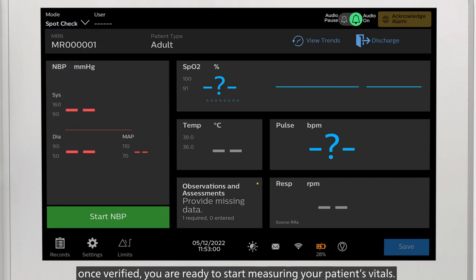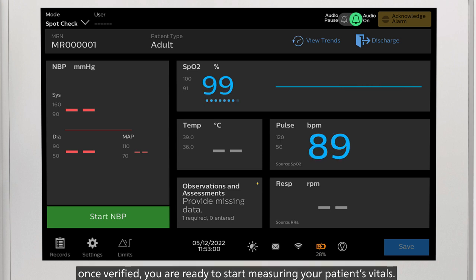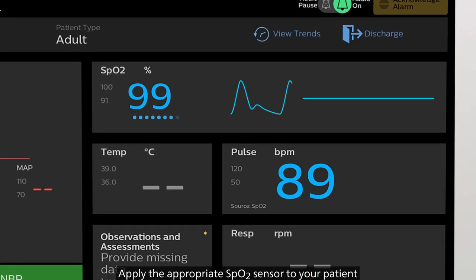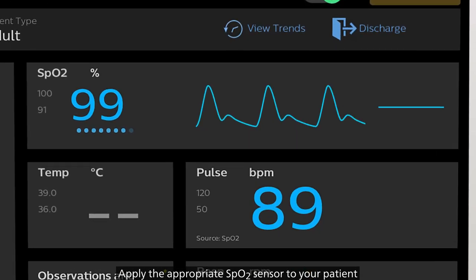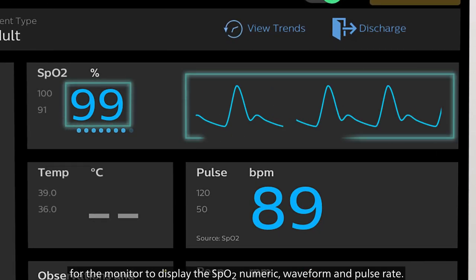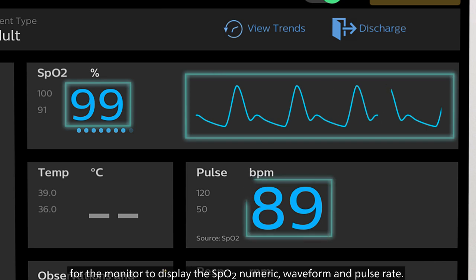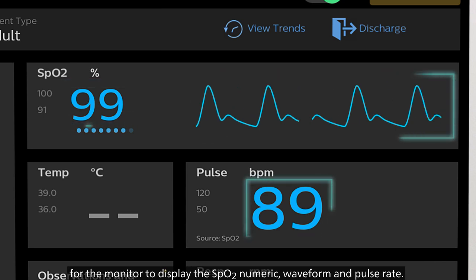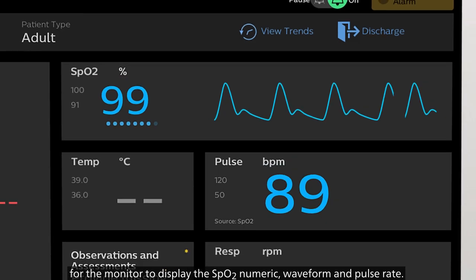Once verified, you are ready to start measuring your patient's vitals. Apply the appropriate SpO2 sensor to your patient for the monitor to display the SpO2 numeric, waveform, and pulse rate.